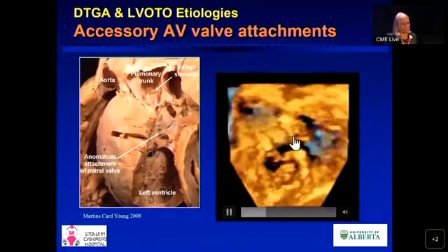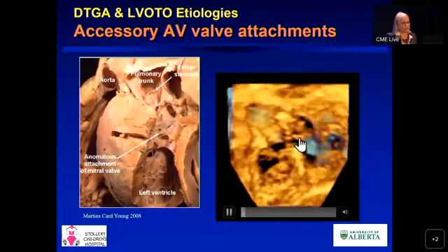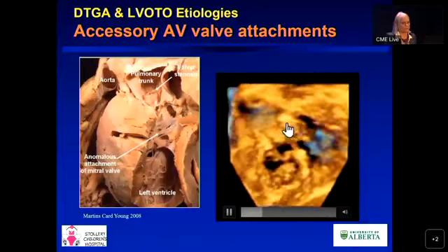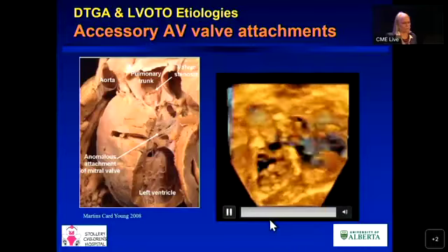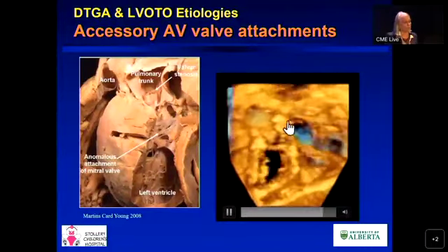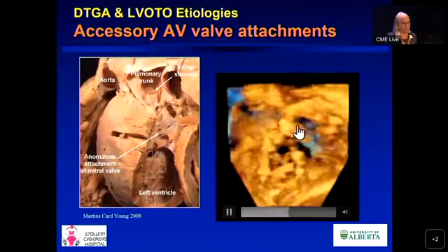So this is actually where the LV outflow and pulmonary outflow would be. And this is actually part of the mitral valve that's sitting up with a cleft right along the upper part of the LV outflow and along the septum. That really made it very difficult for them, they were quite concerned about the subaortic area. And when they're significant, they may be really problematic long-term.